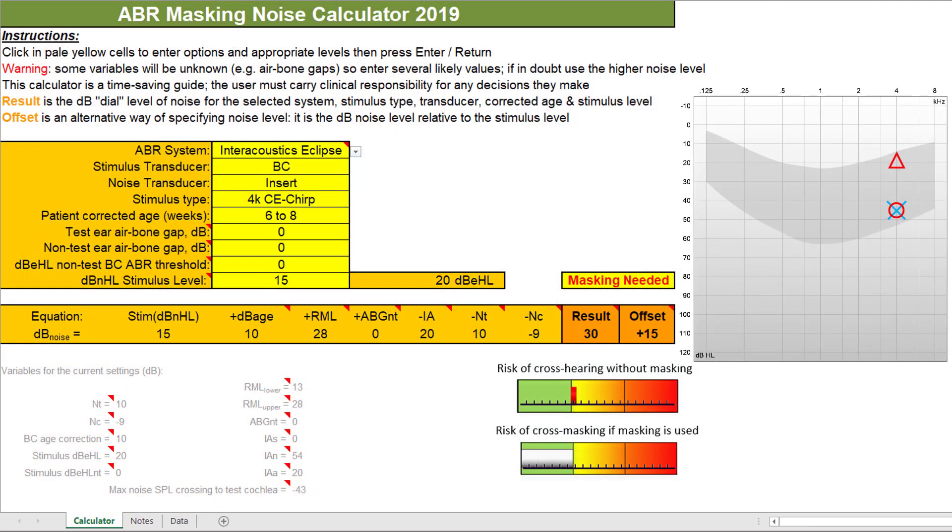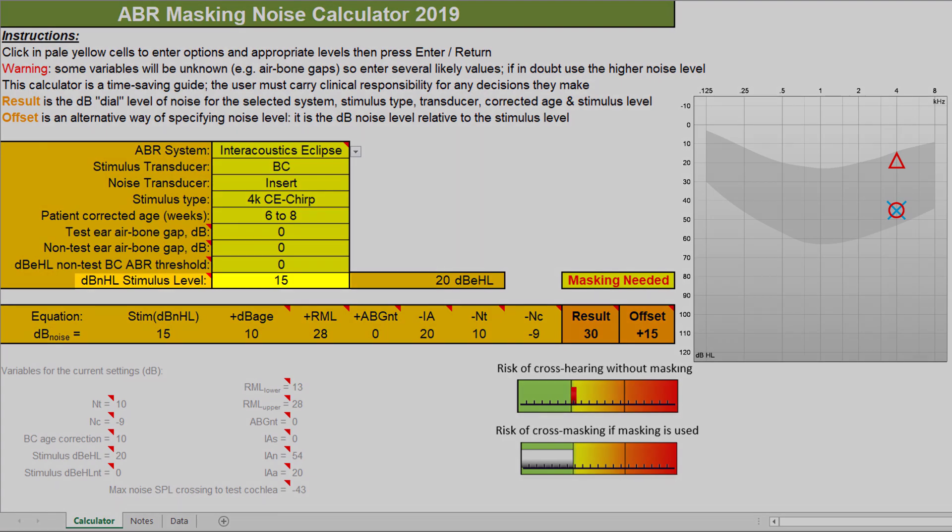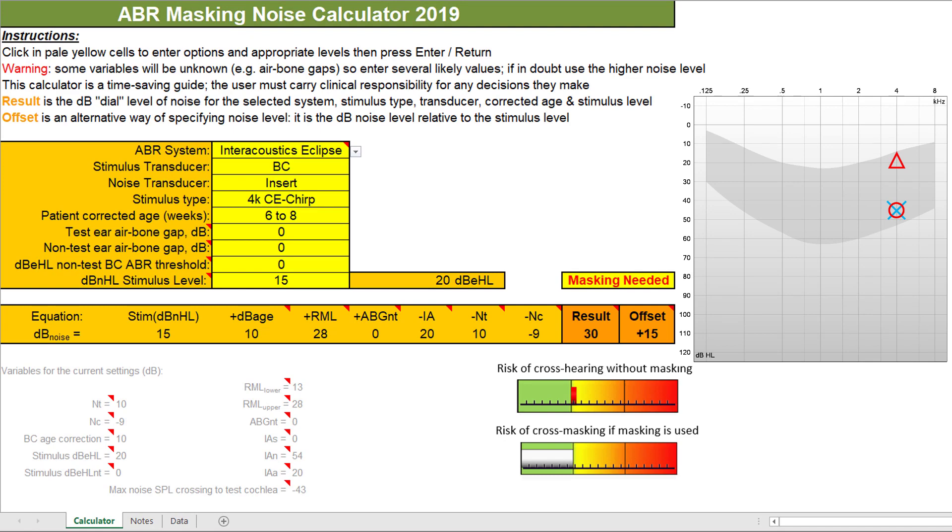It is important to enter the basic information first. This includes selecting the ABR system, transducers, stimulus type, and the corrected age of the patient. The stimulus level is the bone conduction value that you wish to test. Usually, you would start with the not masked value that you have recorded to assess whether this continues to display a response when masking noise has been applied.